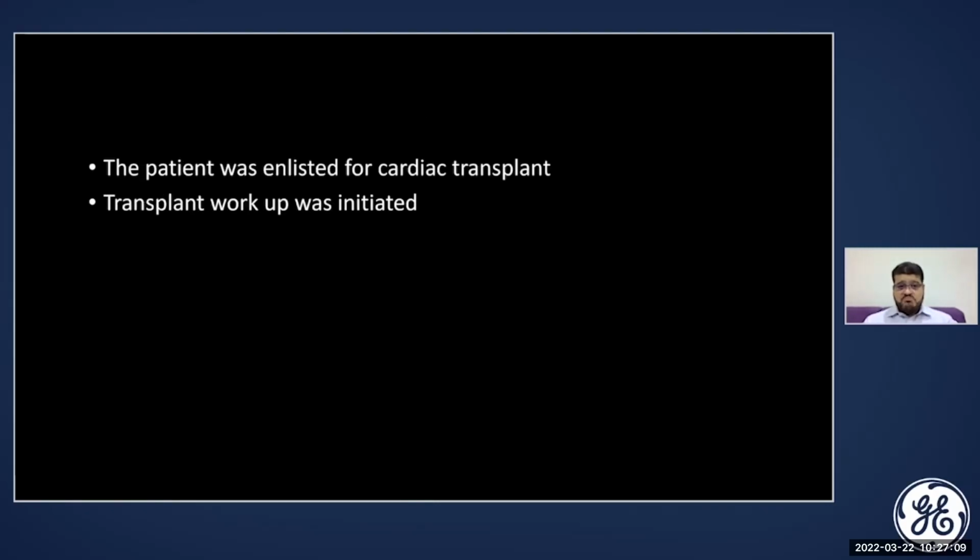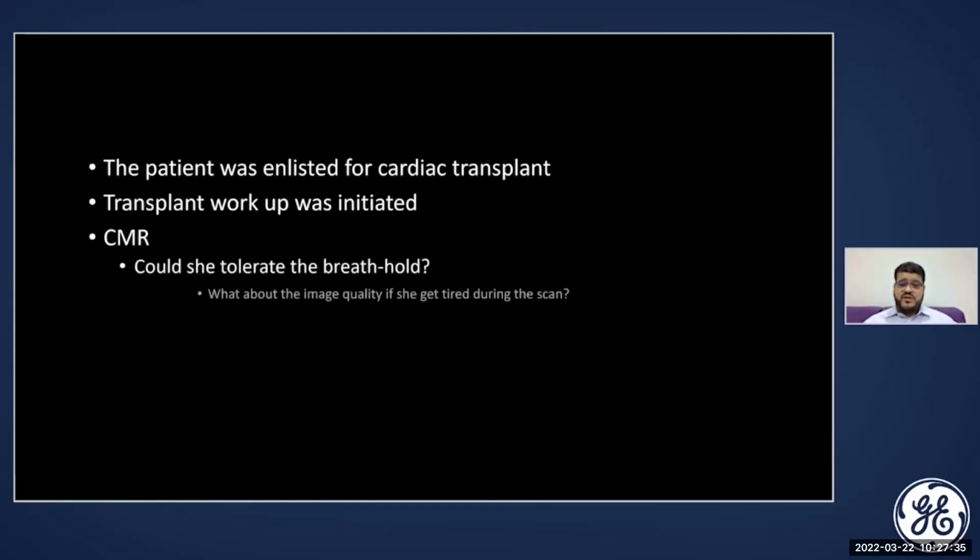Unfortunately, because she remained in our hospital for a long time with symptoms of low cardiac output and volume overload, not responding to medical therapy, the patient was enlisted for cardiac transplant and the workup was initiated. Among the workup was an indication to do cardiac MRI, but two questions were posed to us: could she tolerate the breath hold being in heart failure? And second, what about the image quality if she gets tired during the scan?